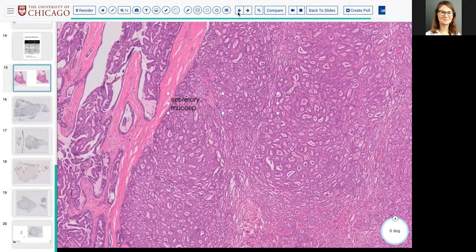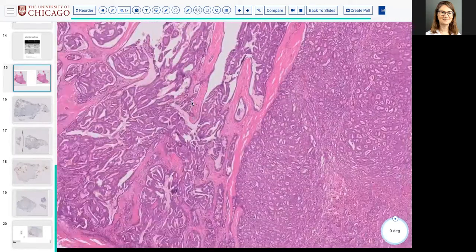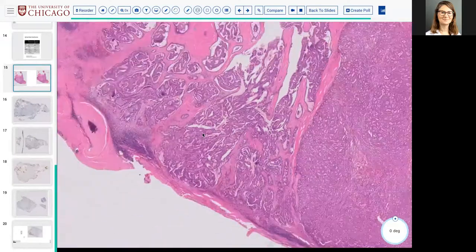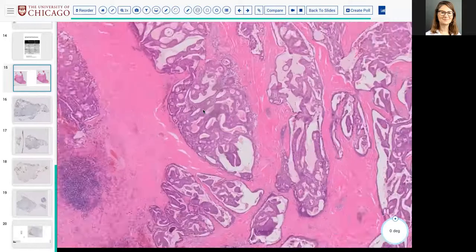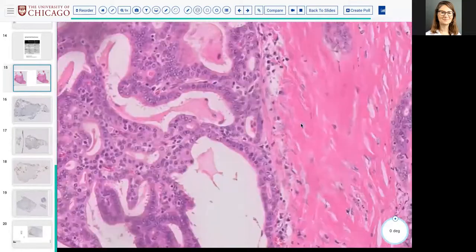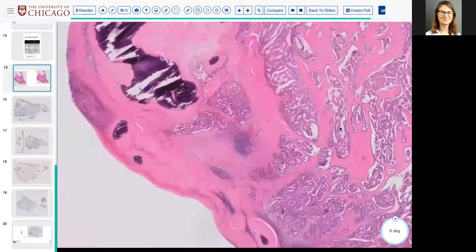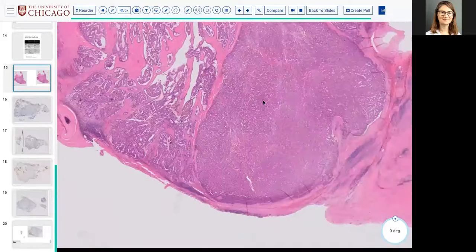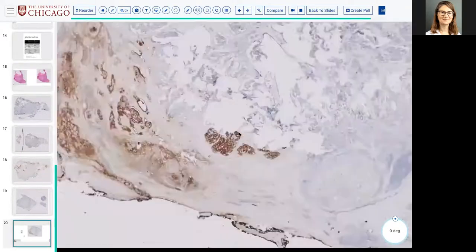This was especially a challenging one because it was called PTC on FNA, because it has papillary and follicular growth. And you could just go by it and say, yeah, okay, sure, it's PTC. But if you watch those subtle nuclear clues and the fact that something is just off, you should get to the right diagnosis. And so even though this was S100 negative, it was mammaglobin positive.